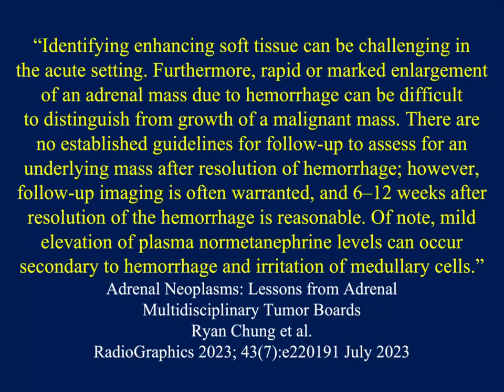Again, in this recent article by Chung, there are no established guidelines for follow-up to assess for an underlying mass after resolution of hemorrhage. However, follow-up is warranted and 6 to 12 weeks is reasonable. The reason you want to follow patients, of course, is you want to make sure there's no underlying tumor present. As I mentioned, sometimes tumors can rupture. You may not see them. A couple cases I've seen, we've done the entire chest and abdomen. We picked up lung cancer.